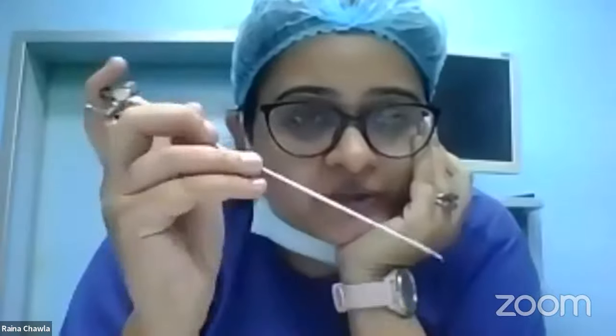The principle of laparoscopy is creating a pneumoperitoneum, which basically means gas in the abdomen. If the abdomen is distended with gas, we are able to see much more clearly and visualize the structures under magnification. It becomes very easy once the abdomen is distended with gas. The gas we commonly use is carbon dioxide.